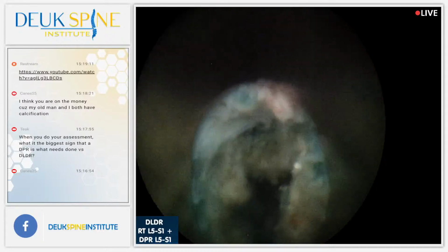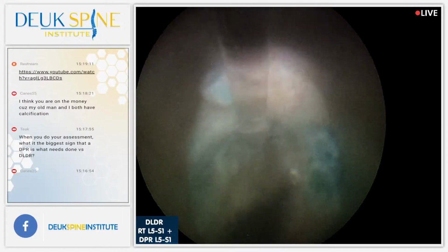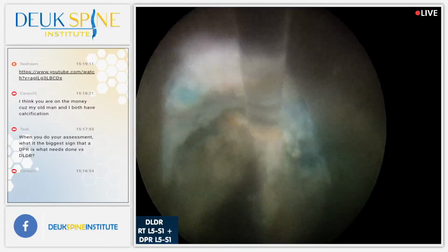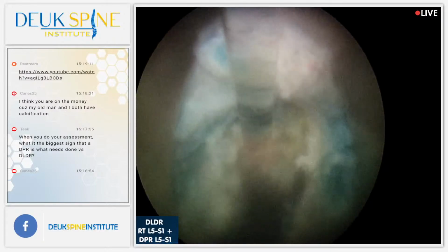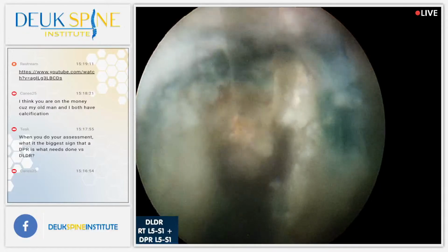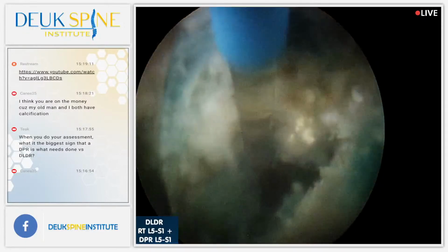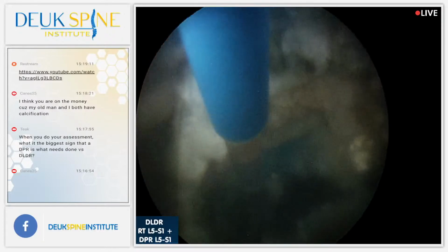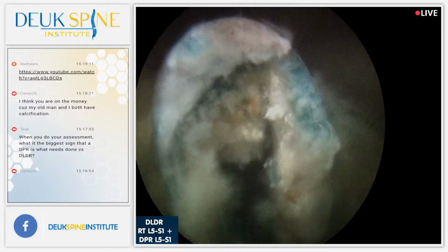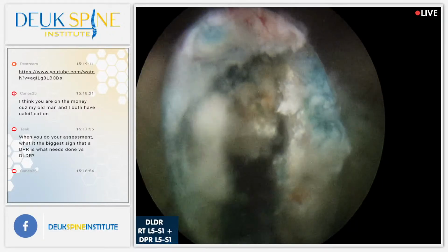Just about done, doctor. I need 1 minute and we're done. A lot of inflammatory tissue down here. And he does not like this, I could tell. 1 minute left. No. We're done. I mean, I just have to finish this. Just trying to get as much as I can get out. I want to do one more grab. See if I can get a little more.